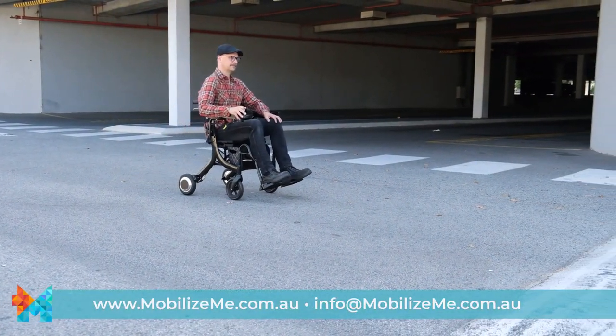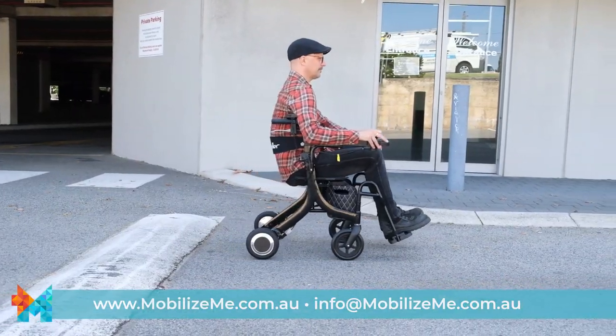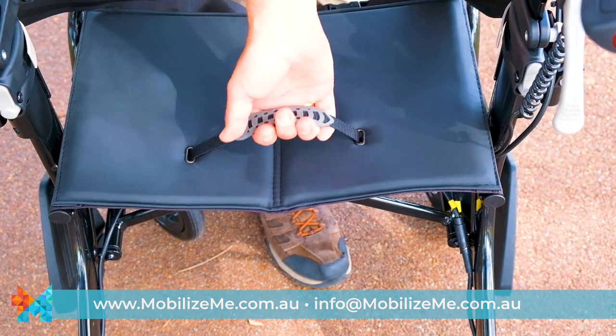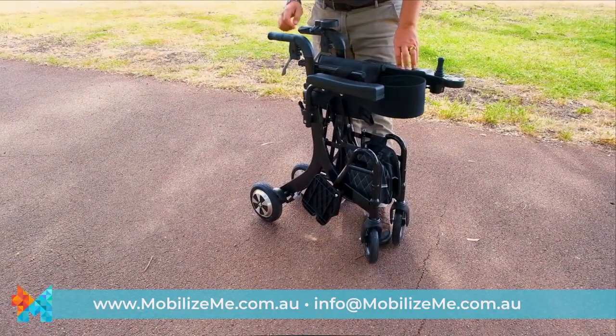The Evo is well-suited for use indoors, paved surfaces and unpaved even surfaces, handling small bumps easily and safely. To fold it, simply flip back the footrests if they have been used, then lift the centre handle in the seat to collapse the Evo.